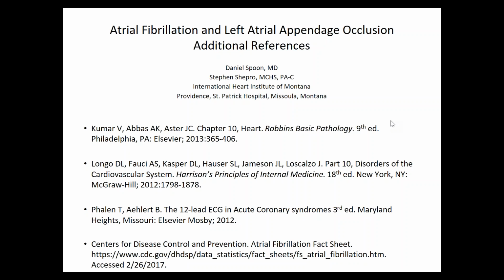Yeah, and so over time, because we'll occlude it with blood in there, the blood will clot, and long-term clotted blood forms basically a fibrinous solid product that can't go anywhere. And that's why we look for the leak. We make sure we have a great seal. Because in reality, we don't care what happens behind there, but it basically walls it off, and over time, that clot basically turns into a tissue. It basically just gets fibrin deposited through it. And so you had an open windsock, and now you've got a completely closed solid structure.